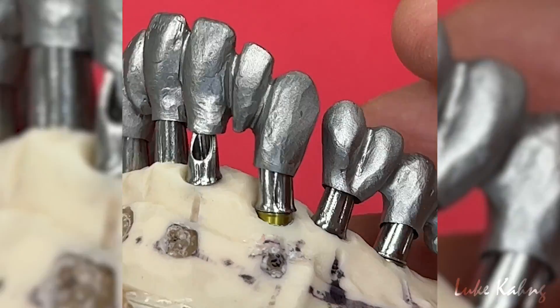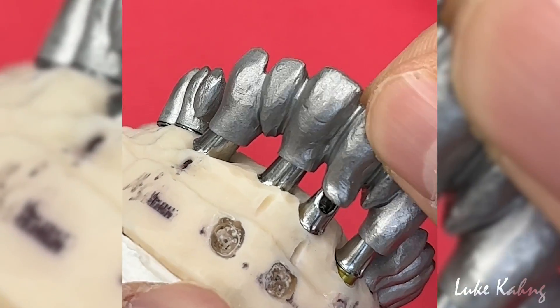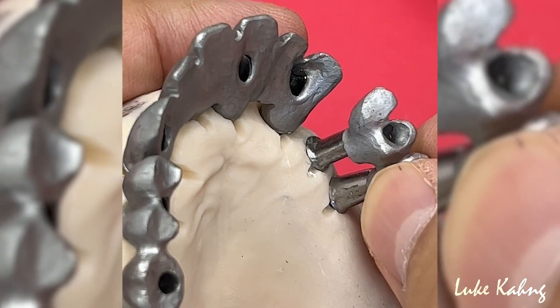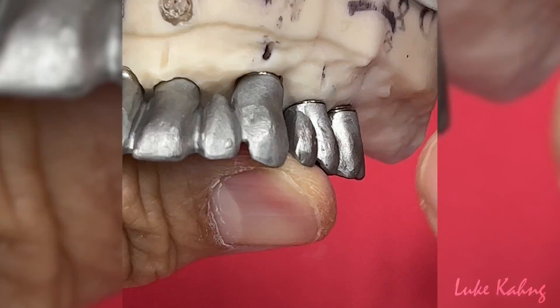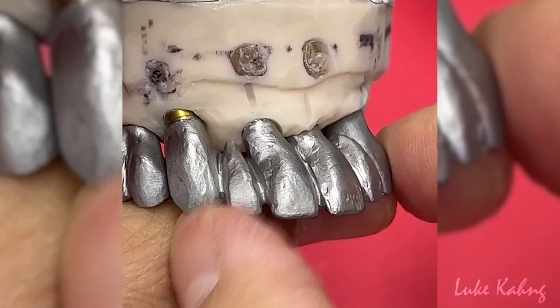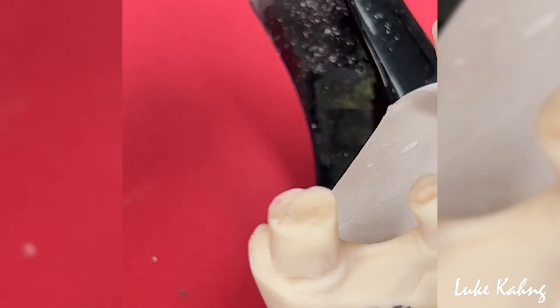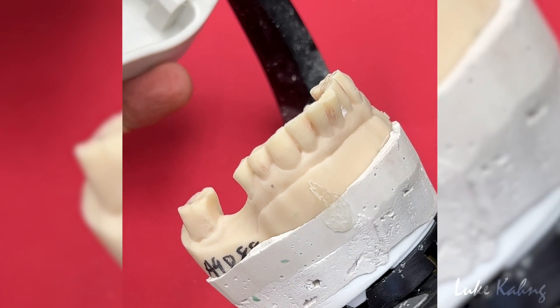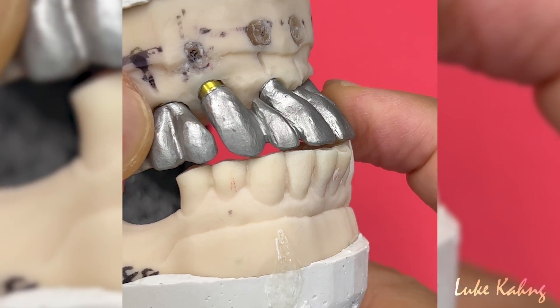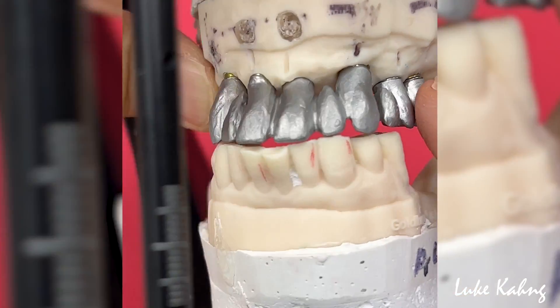To finish the full-mouth screw-retained framework — ready to send in for try-in. Here is exactly where we cut it: more divided, more open. Here is more open too. And especially the bite — we try to get better facial contour. The only one is a proper contour, nice, and we can do it with the finishers. We have to try.